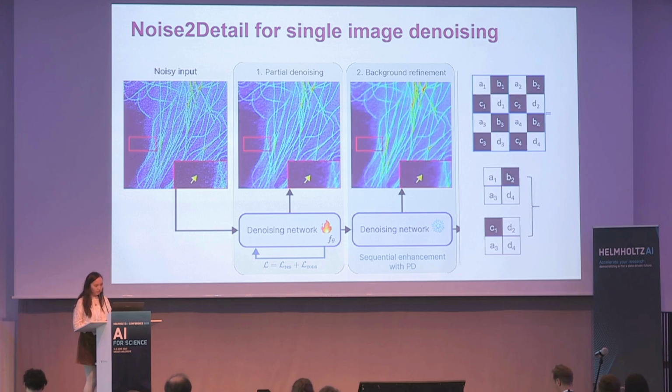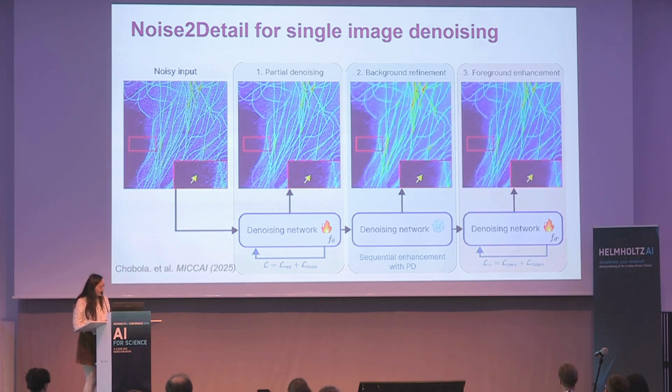You see the foreground, these fibers, seem to be enlarged, because they are getting blurred. So you basically have a problem on the foreground. That's why in the last step, he fed this blurred image in and used the original noisy image as the output to train another denoising network. The input is basically the background, which is already fine, but the foreground is a bit blurred.